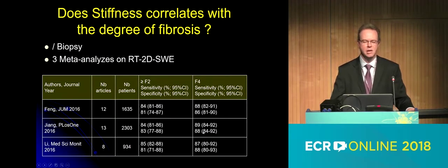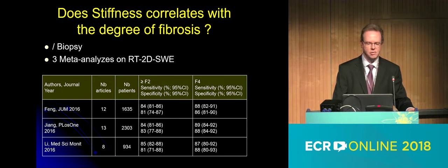So very good sensitivity and specificity to diagnose F2 and F4 with real-time 2D shear wave elastography.